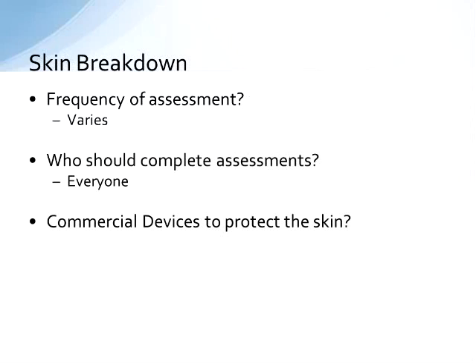So that might mean having 2 different types of interfaces available for your patient. So you might use an oronasal mask and the face shield, changing the pressure points on those patients in order to prevent the skin breakdown, which is actually pretty successful for us in terms of alternating that. And we tend to do it every 4 to 6 hours in our patients if possible. Some patients a little bit longer than that, but that seems to help in terms of changing those pressure points.